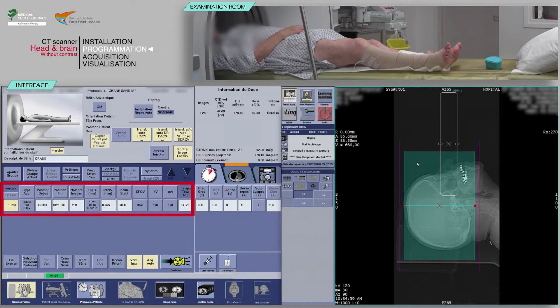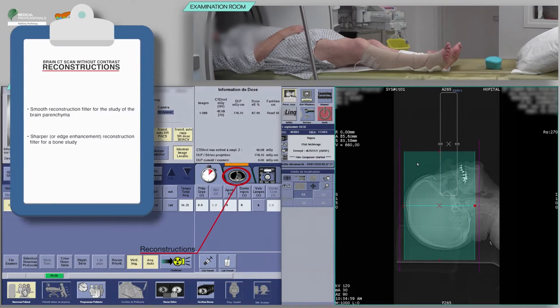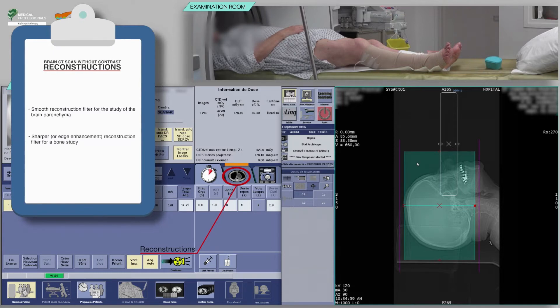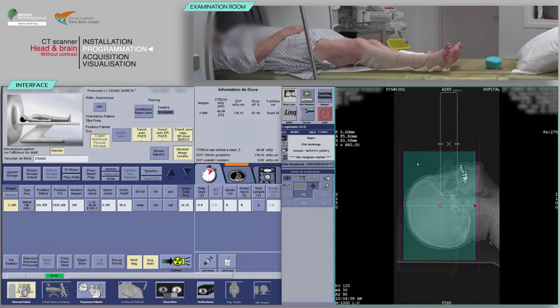Check the consistency of the acquisition parameters, which often are pre-configured. Check the reconstruction boxes. For the acquisition of a brain CT scan without contrast, you will need at least a smooth reconstruction filter for the study of the brain parenchyma and a sharper or edge enhancement reconstruction filter for a bone study. Before continuing, check that the predicted dose is consistent with the diagnostic guideline values.